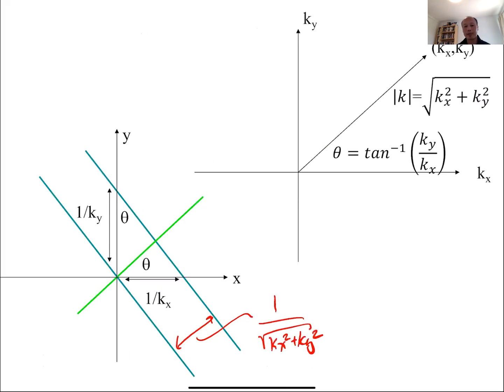And then if you look at the supplementary session 2 notes, I think there's more detail on that. But in terms of how to think about K-space, probably the best rule of thumb is as follows. Let's say you're given some arbitrary place in K-space. Okay, so let's say I'm out here in K-space. What you can think about doing, if you want to think about the spatial pattern that corresponds to that place in K-space, is just draw a vector from that point in K-space out to here. Okay, and then if you draw components that are perpendicular to that vector, that will tell you the spatial pattern that's associated with that part of K-space.